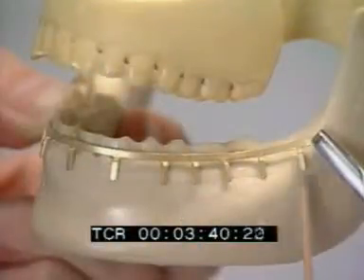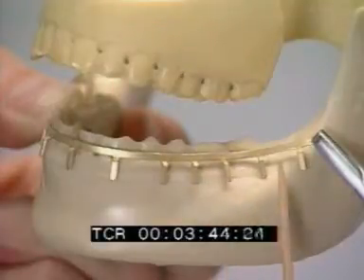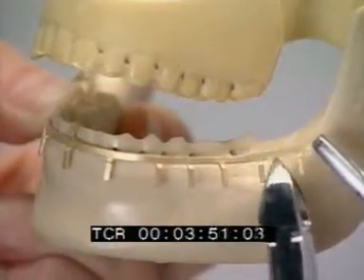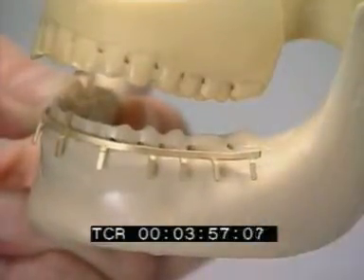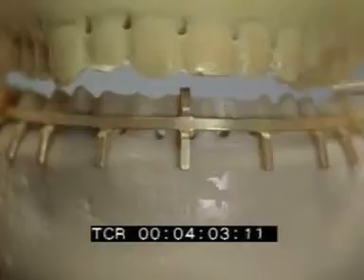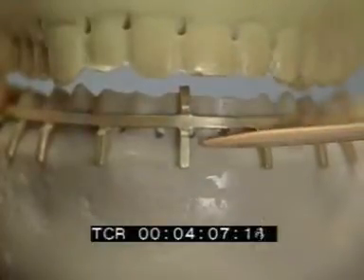If maximum stability is needed, the bar is cut behind molar number 7. But if less stability is sufficient, the bar can be trimmed behind premolar number 5. The occlusal hook prevents the arch bar from sinking to the level of the gingiva by following the smaller diameter of the tooth towards the root.